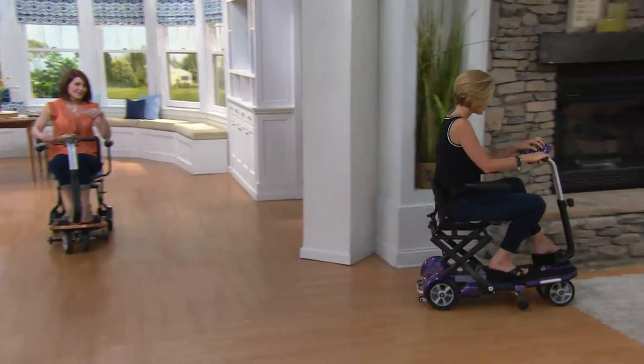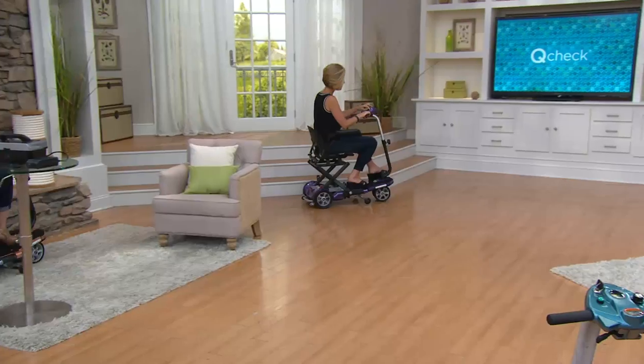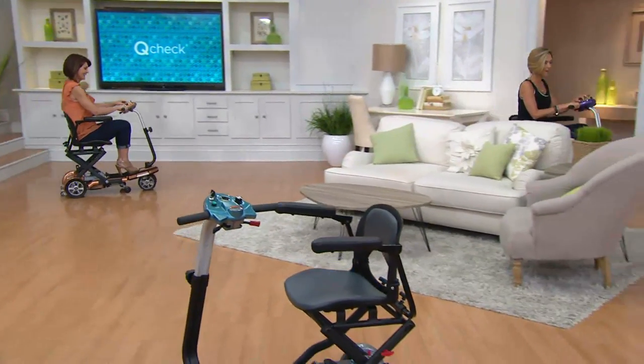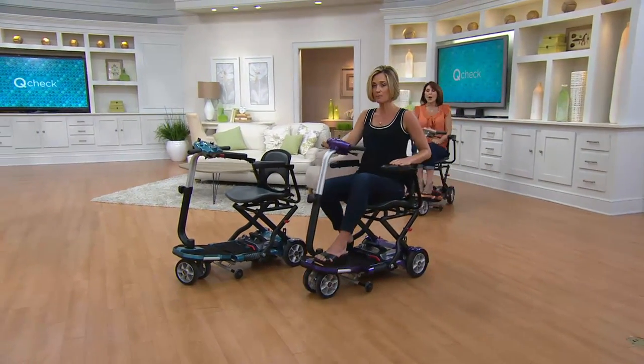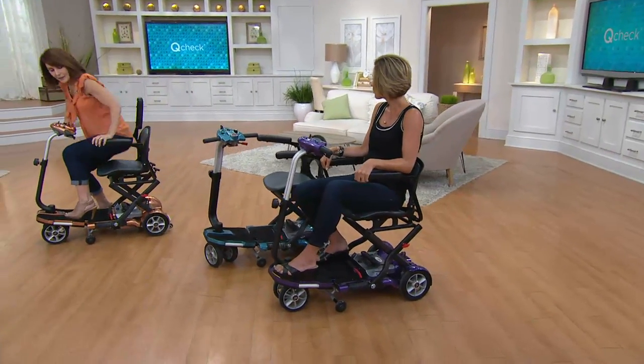You can get faster or slower while you're driving — up to four miles per hour. This has more battery life than the last version. It has the armrests, and as mentioned, it comes basically fully assembled. You just have to put on the armrests if you choose — and they are removable. We've had people taking this on vacation since we've been presenting it with QVC.